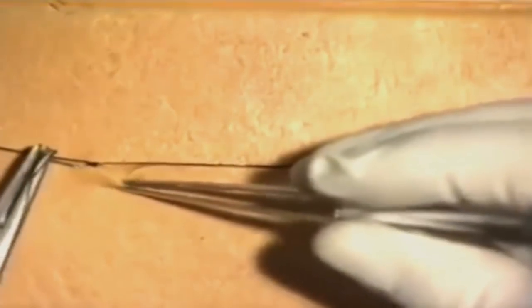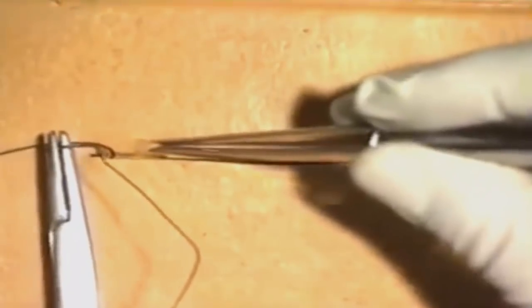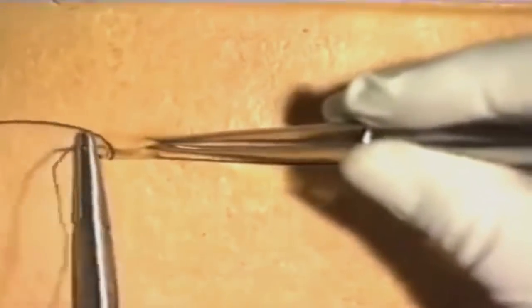Take a small bite of the subcuticular material and pull the suture through. Then on the opposite side of the wound, insert a similar subcuticular bite of the suture material and gently work up the wound, ensuring that each bite does not go too deep into the tissues.